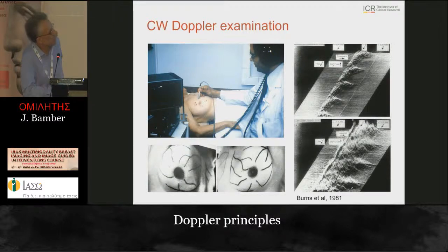And this corresponded to very small vessels, very high frequencies, low vascular impedance causing flow in diastole. You can see the systolic pulse and diastolic waveform here as you go through different heartbeat cycles. And it persists in diastole in the case of a breast tumour, and you have this complex distribution of frequencies corresponding to beams that overlap lots of microvessels with continuous flow.